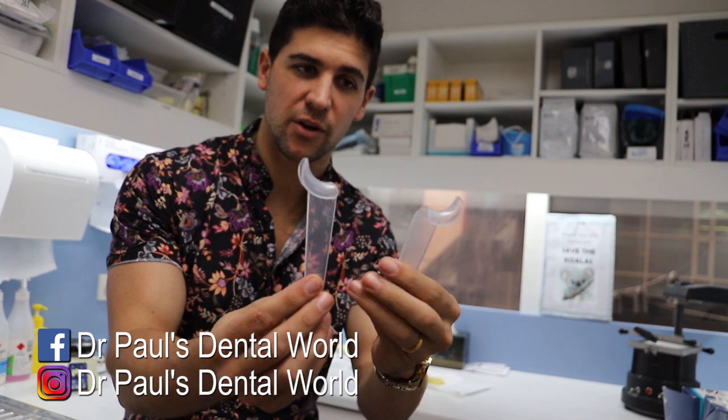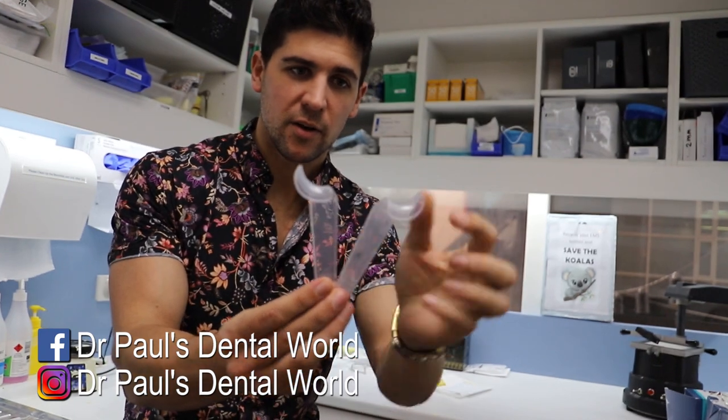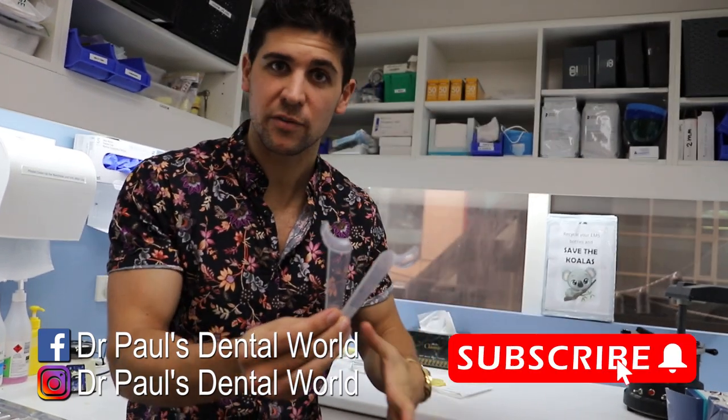Now these are the actual retractors. You can see here that they've got one arm here that's going to pull the lip up, the other arm has been cut off and it's out of the way.